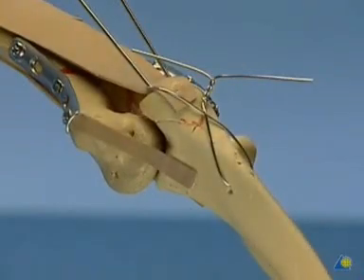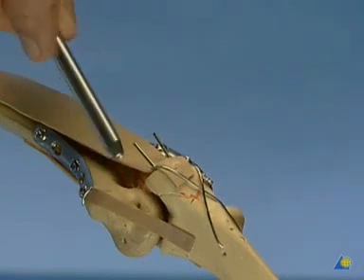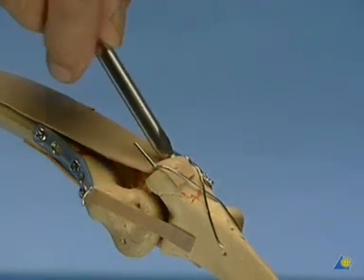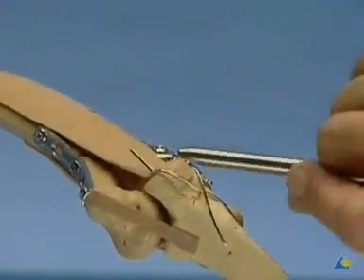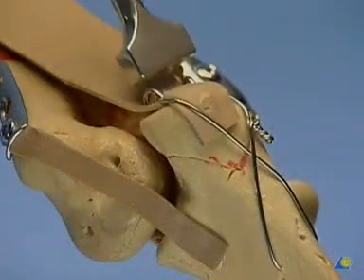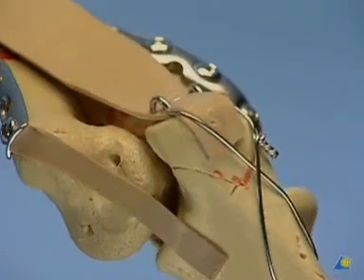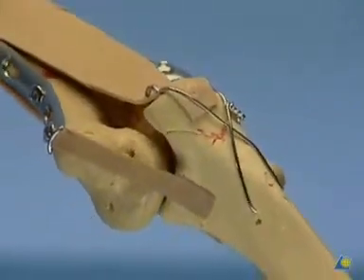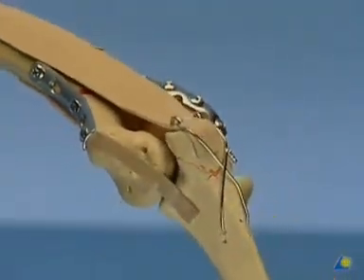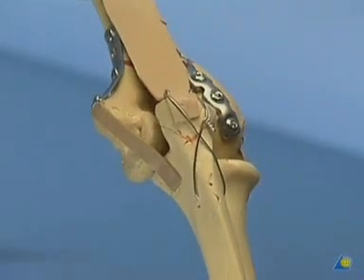The K wires are cut and bent. Now the K-wires are completely sunk into the olecranon. The final aspect of our open reduction and internal fixation of a type C fracture. With good reduction and good fixation, this arm may be moved immediately. A splint will not be necessary.